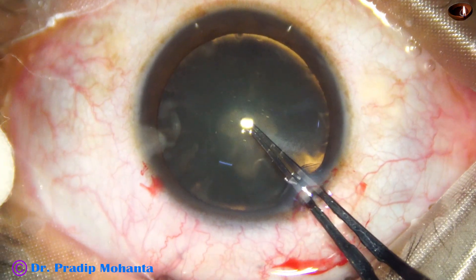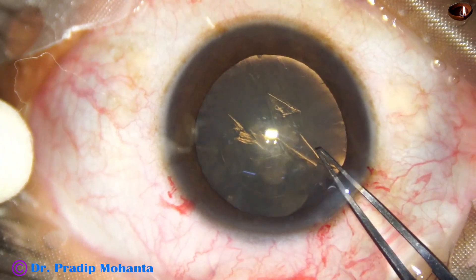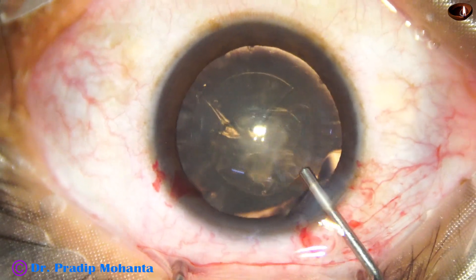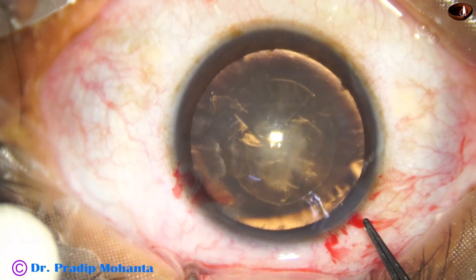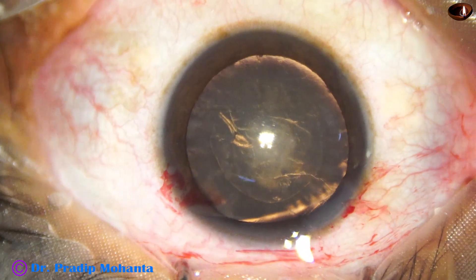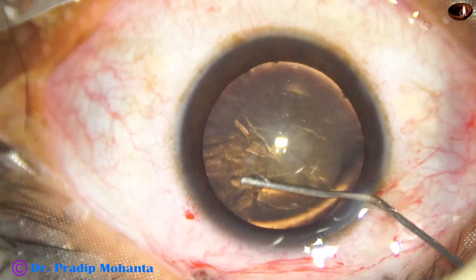Utrata forceps is being used. The tip of the utrata pierces the center of the anterior capsule and a capsular tag is raised. This capsular tag is guided anti-clockwise, and as I make about 180 degrees of rhexis, the anterior chamber becomes shallow. So I come out, inject visco, deepen the anterior chamber, and then use the utrata again. We have to be quick — we have to lift the anterior wall quickly, otherwise the anterior chamber will become shallow again. If it becomes shallow, the chance of the rhexis running out to the periphery is more.